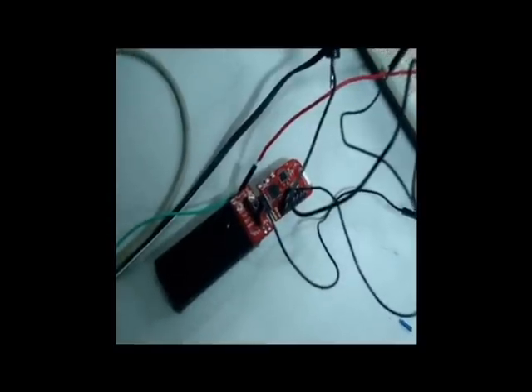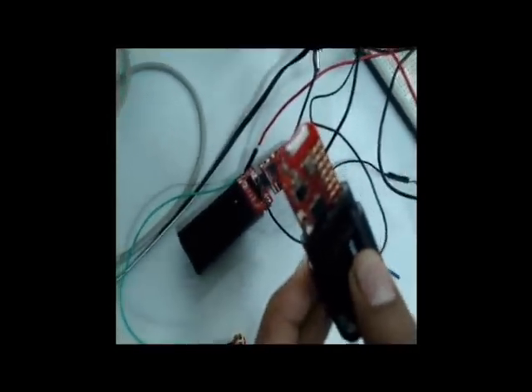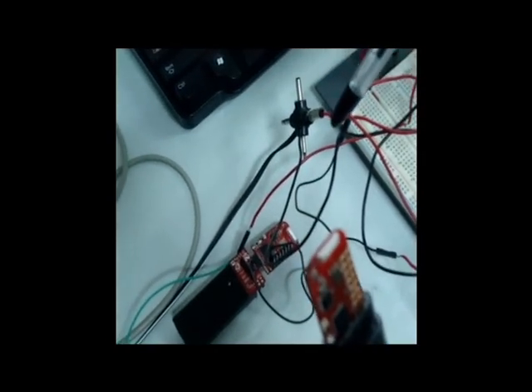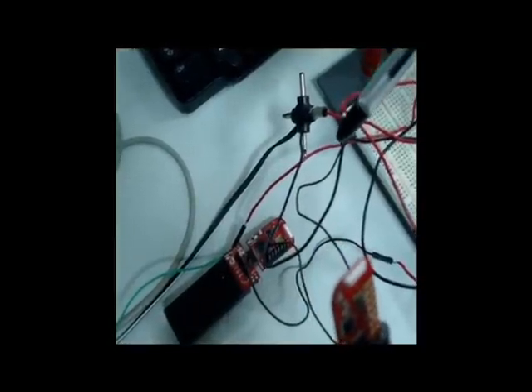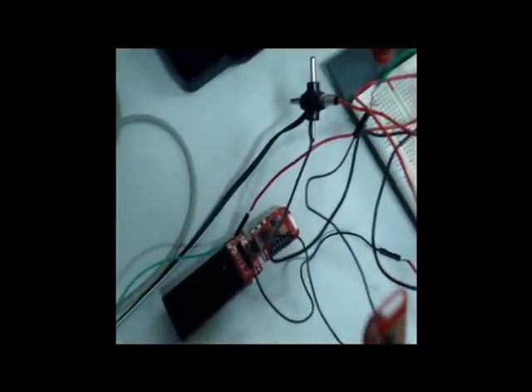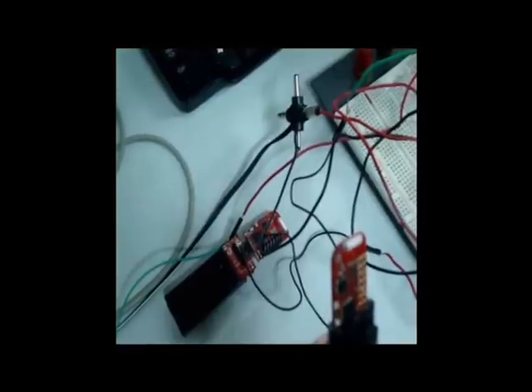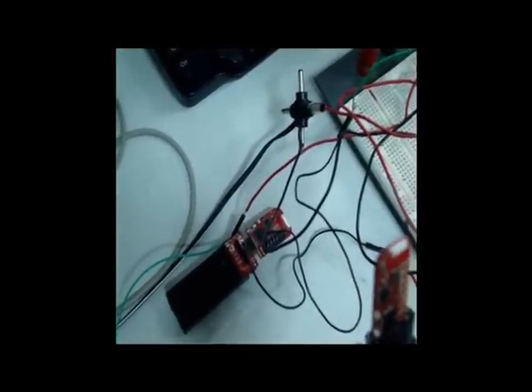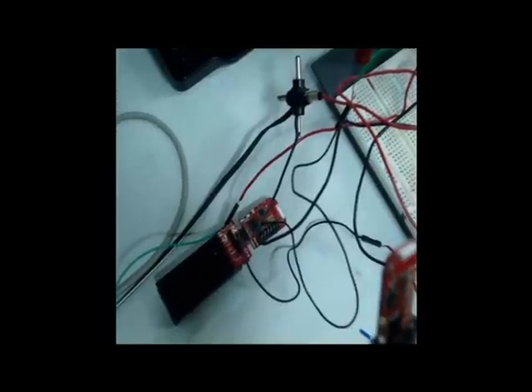To establish the wireless communication, we are using the EZ430 RF2500 from Texas Instruments. This has two identical target boards, one of which can act as an access point or the receiver, and the other one can act as an end device or a transmitter. Each of the target boards comprises an MSP430 F2274 microcontroller and a CC2500 2.4 GHz wireless transceiver. Both the target boards communicate with each other using the Simplicity TI protocol in a simple peer-to-peer fashion.